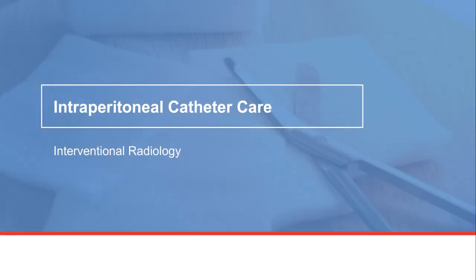In this video, we will show you how to care for your intraperitoneal or IP catheter. This is a non-tunneled intraperitoneal catheter. We will also review common concerns or issues and how to troubleshoot them.